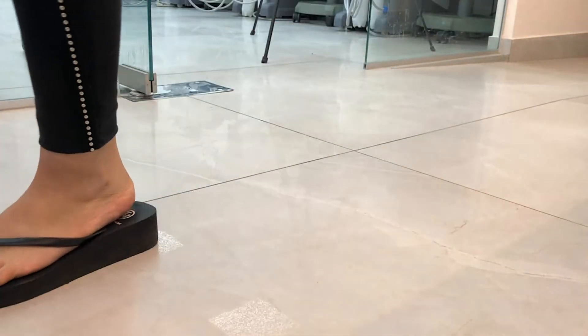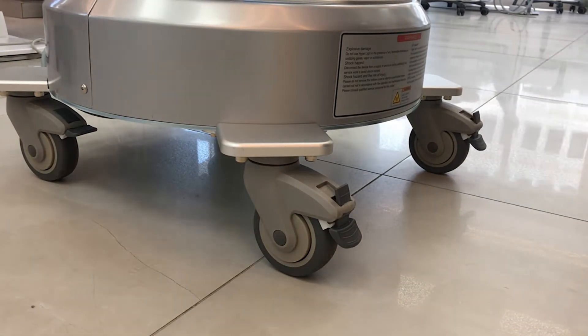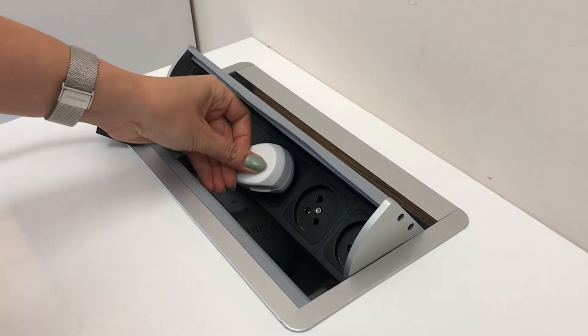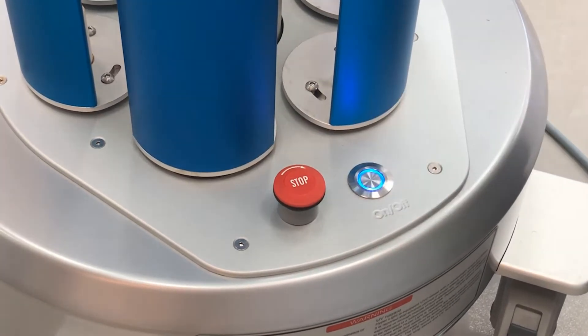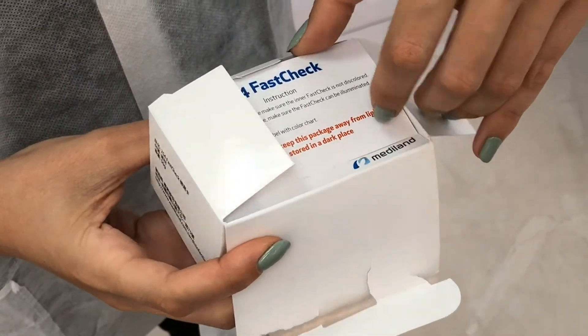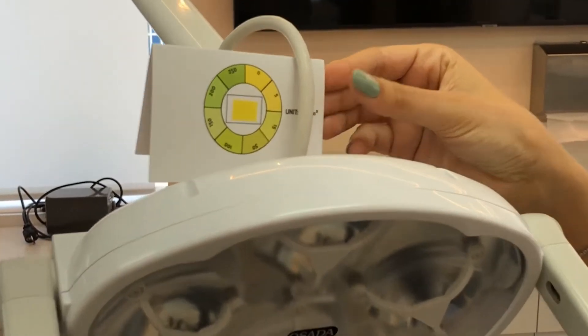Hyperlite is easily movable and designed to completely disinfect the dental clinic in a matter of minutes. In between patients, we lead the device to a central area in the operation room, connect it to electricity, and turn the device on. Control cards allow us to test the efficiency of UV radiation exposure in different areas of the clinic.